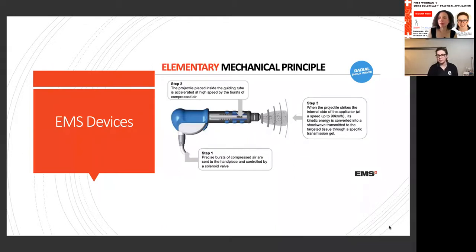We've also got the power handle, which is a red handle, and that is a little bit of a different device. It's much more powerful and used for more bony indications. So the Evo handle we tend to use for tendinopathies a lot and for musculoskeletal type indications.